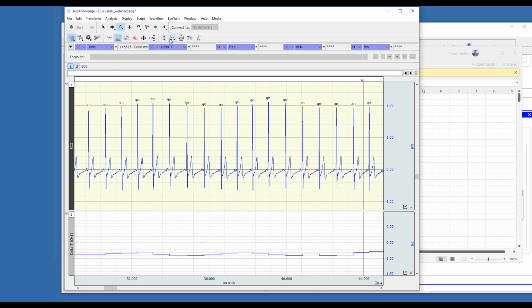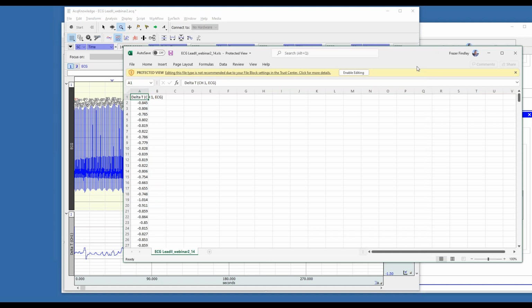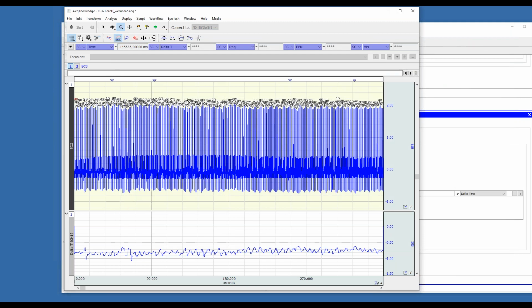Then I can eyeball this and make sure that my data is in the physiological range before I perform any HRV analysis. The find cycle was really excellent for teasing pieces out and labeling and extracting measurements, just the way we did it there.